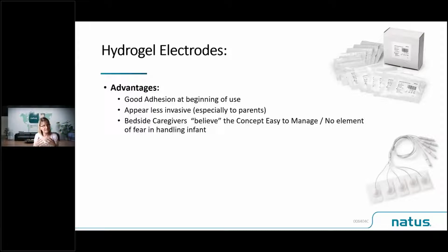So parents can sometimes be a little more accepting of hydrogel electrodes. And we often, as we're talking to bedside caregivers, believe that the concept must be easy to manage. There's no element of fear in handling the baby because it's just something we're sticking on.